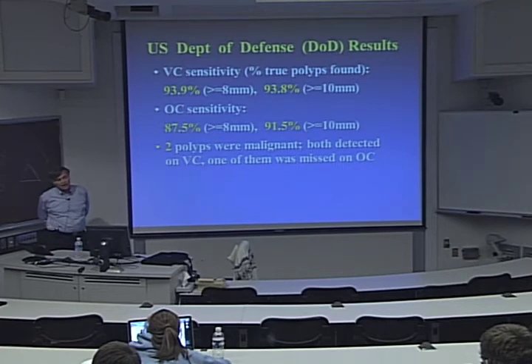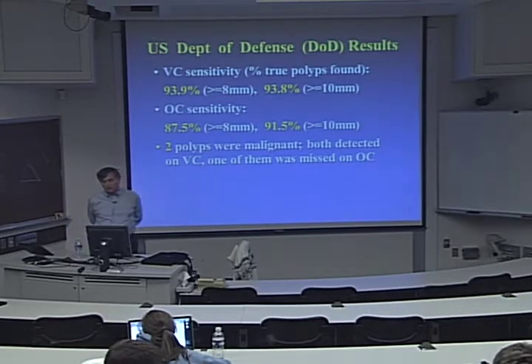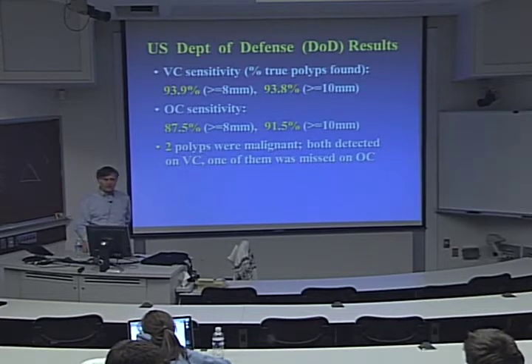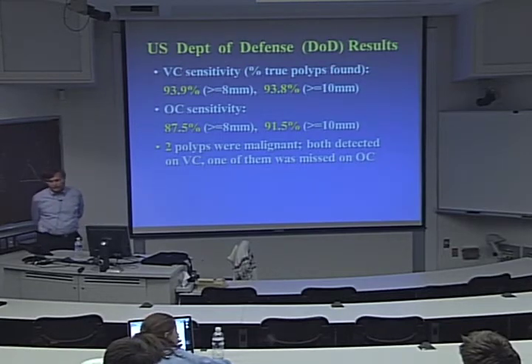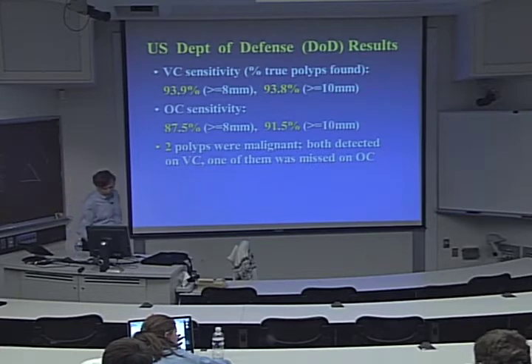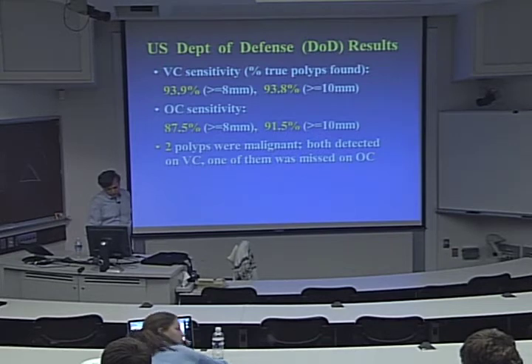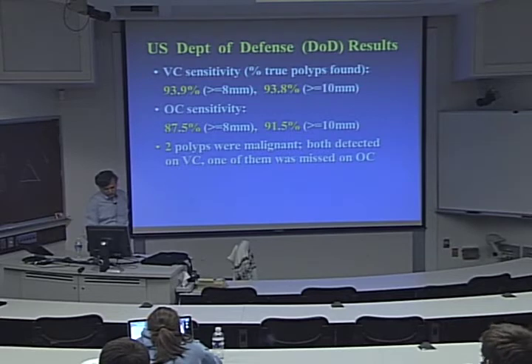Use the ground truth to be the pathology, right? In this field, the ground truth, the gold standard, is indeed the optical colonoscopy. That's how it works. It's the optical colonoscopy combined with the pathology. This is the ground truth. This is the gold standard. You're not going to do that. Anyway, we need to read this New England Journal of Medicine paper again to figure that out.